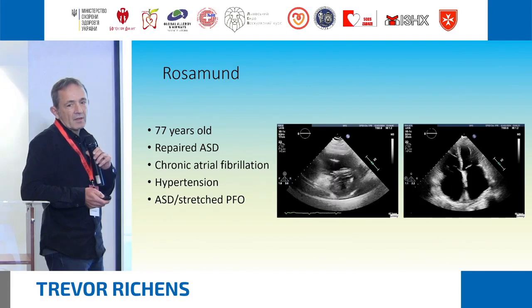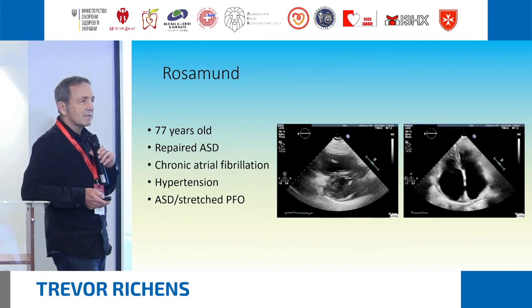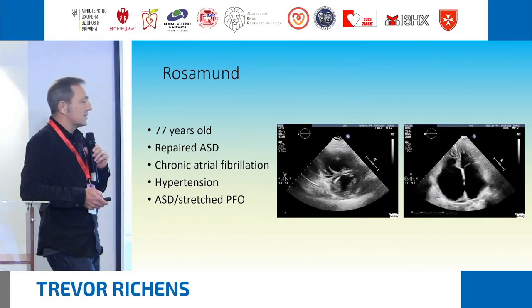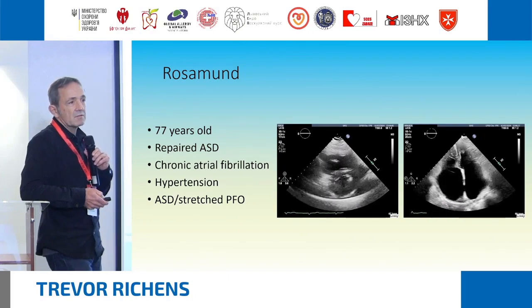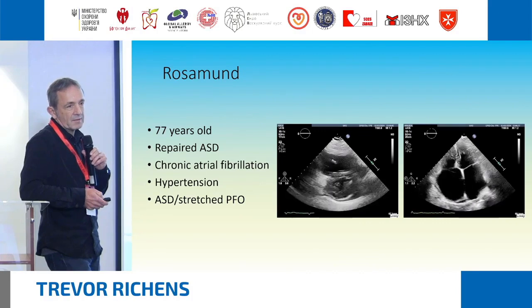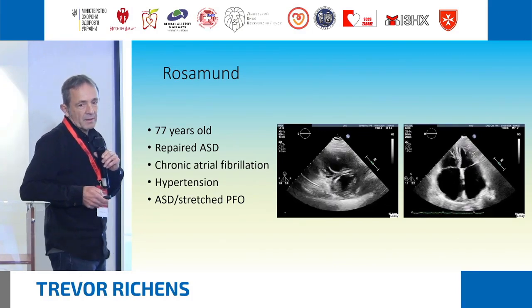So I thought I'd start off familiar with an older patient. This is a patient I studied in October, Rosamond. She's 77 years old. She has a repaired ASD, atrial fibrillation, hypertension. And we noticed she still had a residual ASD, or it could be a stretch PFO.